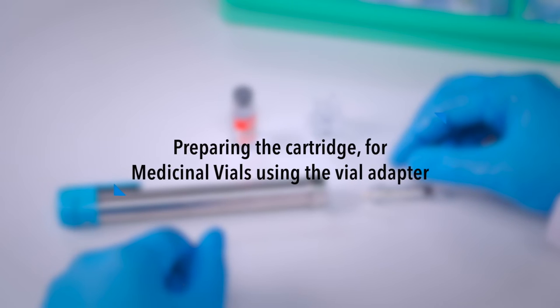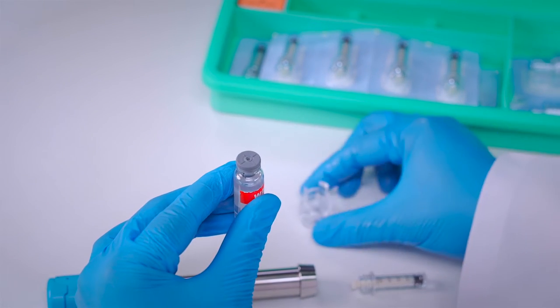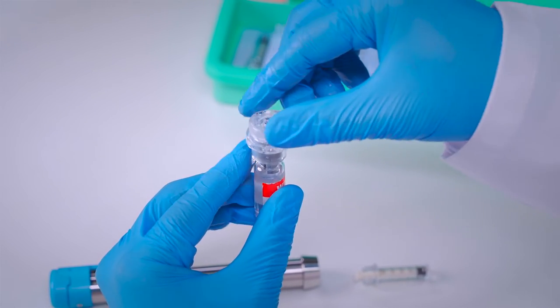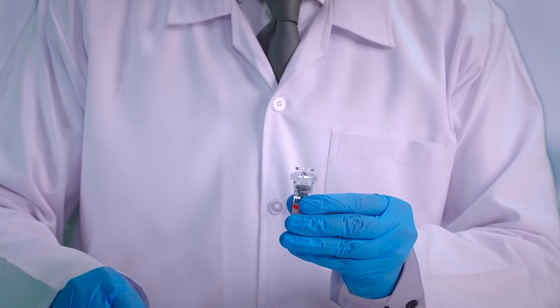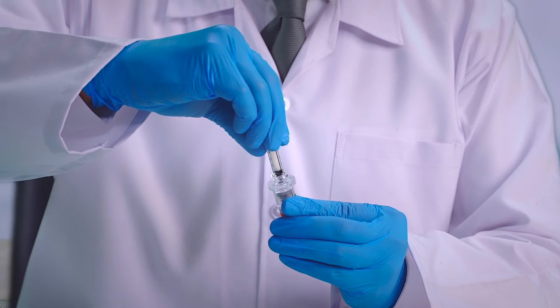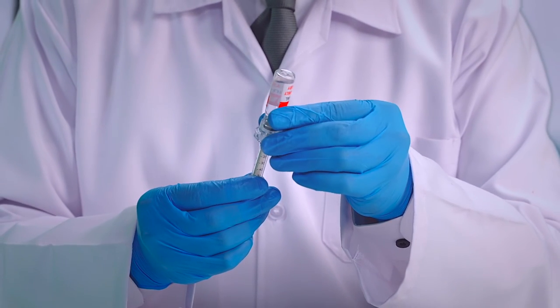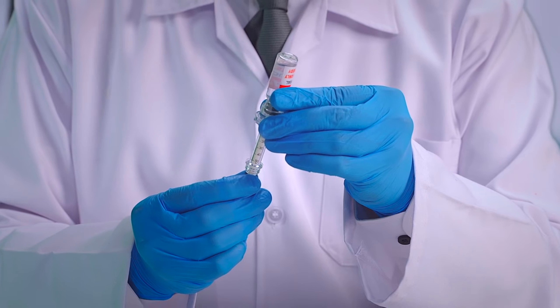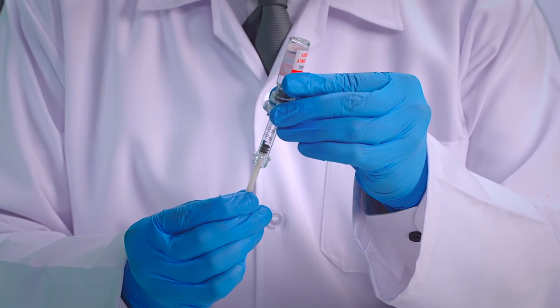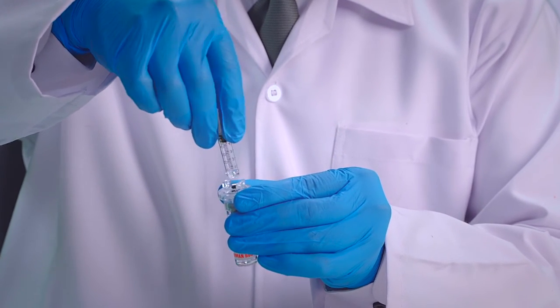Preparing the cartridge for medicinal vials using the vial adapter. Insert the vial adapter spike into the center of the vial. Remove the safety cap from the other end by turning counter clockwise. Select the cartridge tip by turning clockwise until secure. Pull back the plunger to the required dosage fill line. Remove the filled cartridge by turning counter clockwise and follow all other procedures as mentioned earlier.